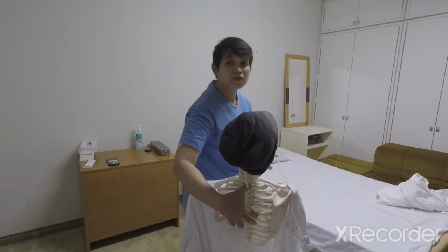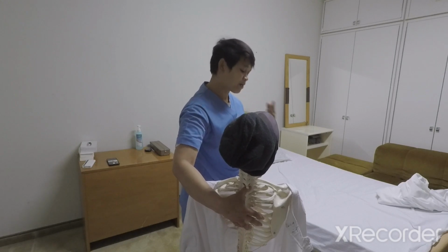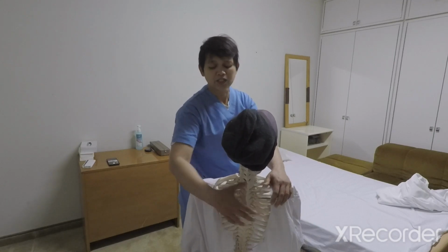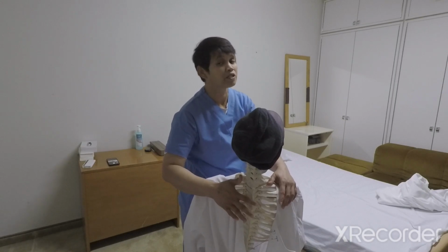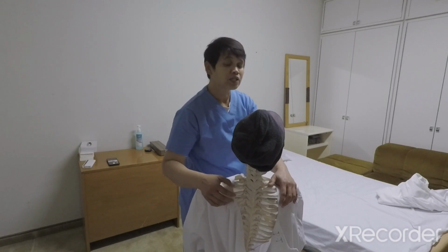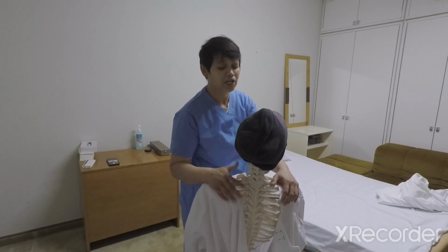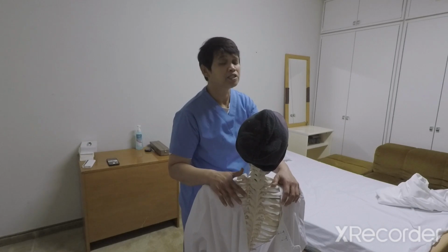And now, we will transfer the patient from chair to bed. When we transfer the patient, we should ask if she's feeling dizzy or not. Let's keep in consideration that the first time they get up from the bed, some patients will feel dizzy.